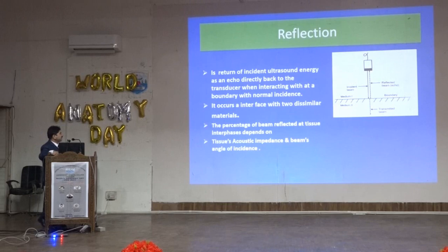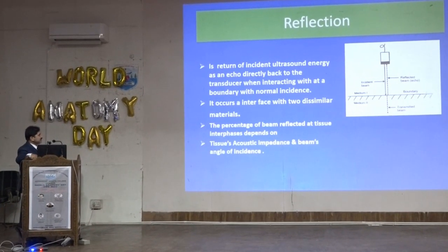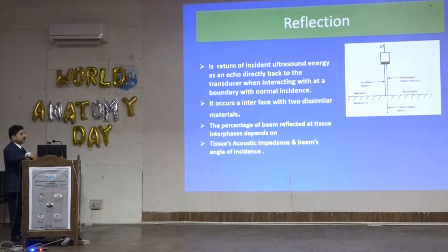So by reflection we mean the return of incident ultrasound energy as an echo directly back to the transducer, interacting at a boundary with normal incidence. It occurs at the interface of two dissimilar materials. The percentage of beam reflected at the tissue interface depends on the tissue's acoustic impedance and the beam's angle of incidence.